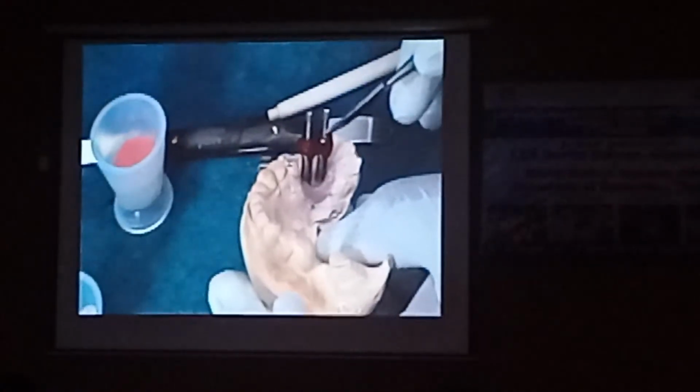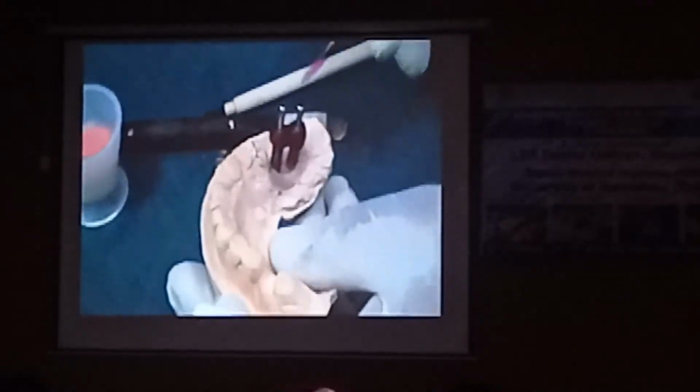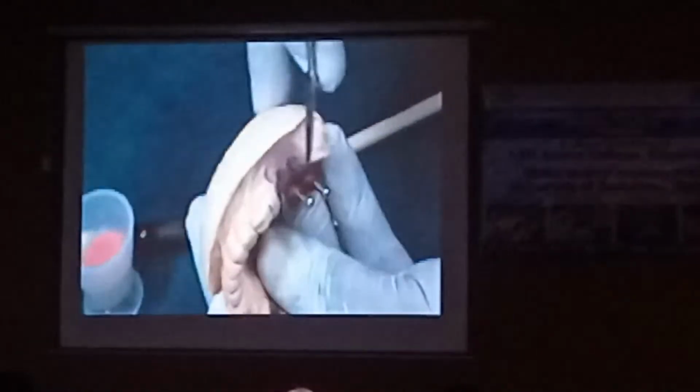What we have here is, you should ensure that the screws are free. Now, if you see this jig, this is uniform, 360 degree with adequate width and adequate thickness, right? So that if it is adequate, the chances are that it will be more rigid.